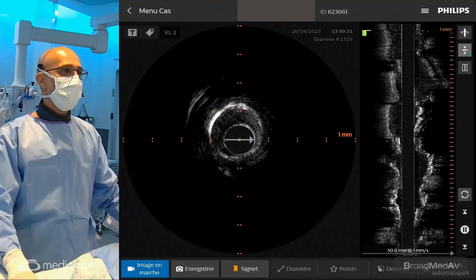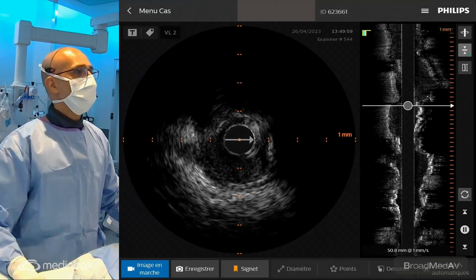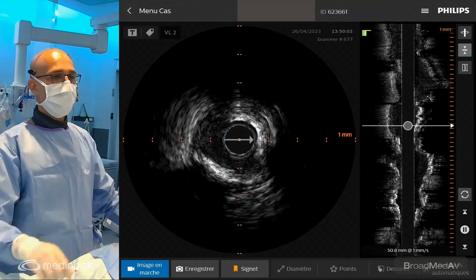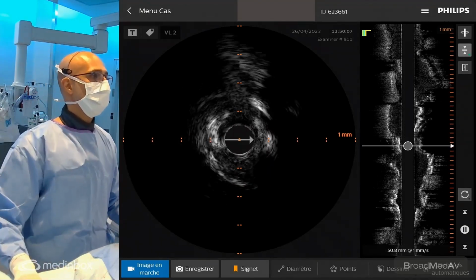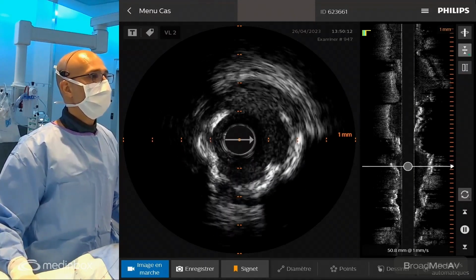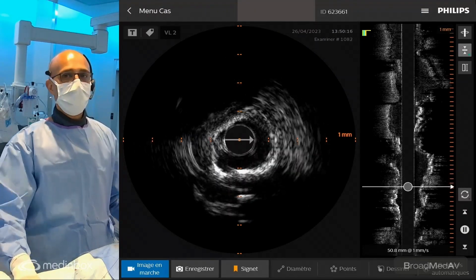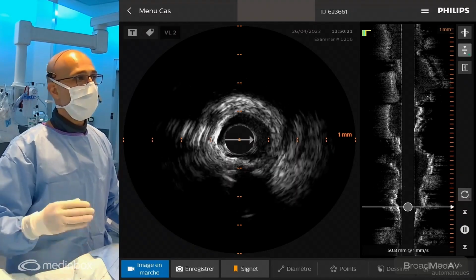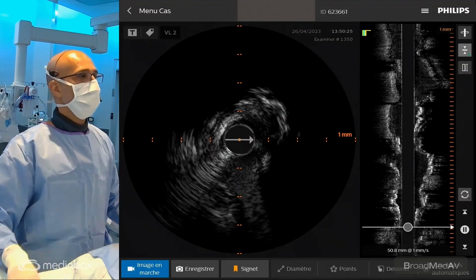After the first IVUS, we performed pre-dilatation. Let's see the pre-dilatation balloons. Observe closely the ostium of the RCA. There's a clear waist, and this is where we saw very deep, thick, concentric calcium on the IVUS. This is a 3.0 balloon that we took up to 18 atmospheres, and we did not get expansion. An error here would be to try to deploy the stent, or even to go higher on non-compliant balloons, because they could rupture and cause aortic dissection at the ostium of the RCA.